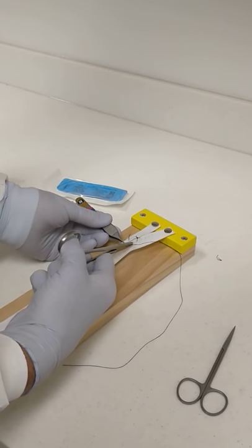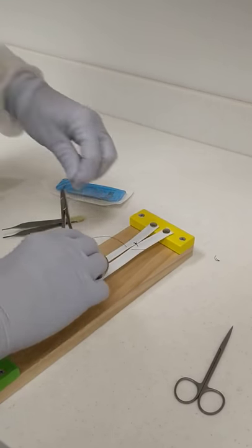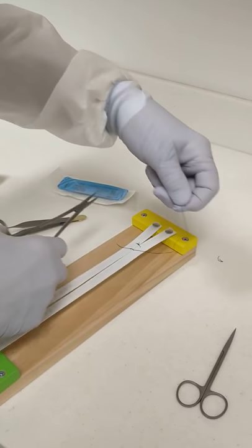And that looks like this. A simple suture is placed.